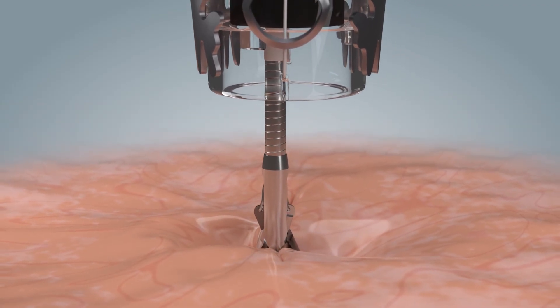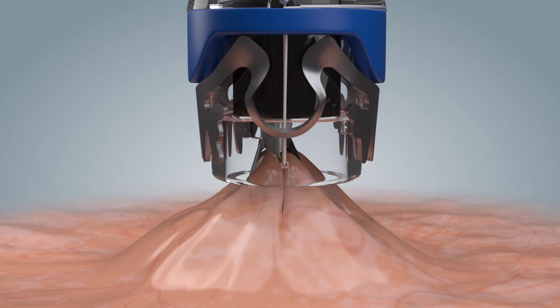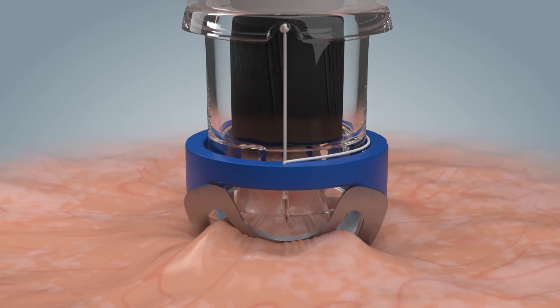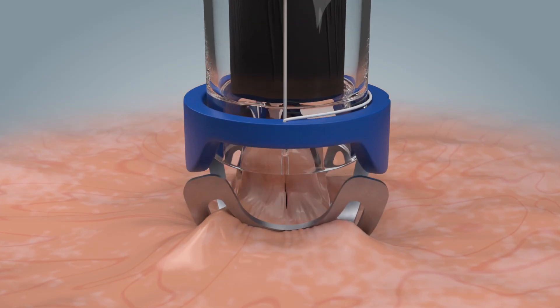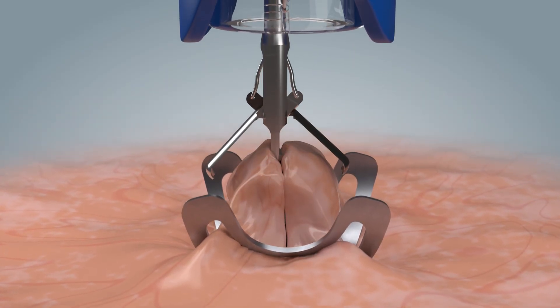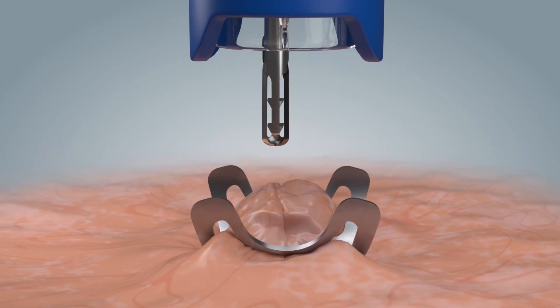Ensure that the instrument tip is fully retracted into the application cap, and the instrument shaft is fixed to the endoscope. Once the clip has been successfully applied, the twin grasper is opened and detaches from the tissue. It can then be removed from the working channel, and the application site can be inspected.